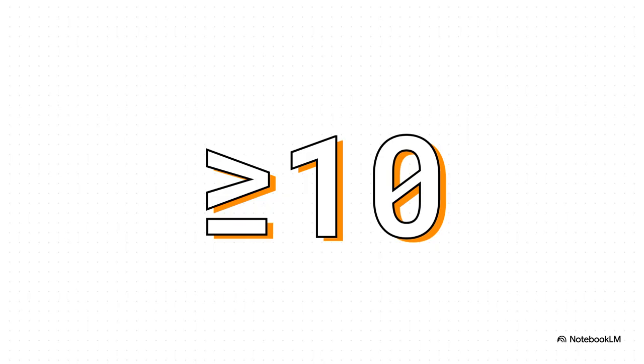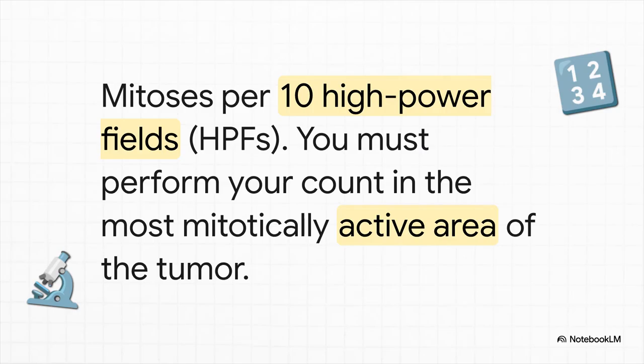The magic number, the threshold you're looking for to call it malignant, is this one. That's 10 or more mitoses per 10 high-power fields. And a really critical piece of advice from the protocol is that you have to do this count in the most mitotically active area of the whole tumor. You have to hunt for that hot spot to make sure you don't undergrade the lesion.